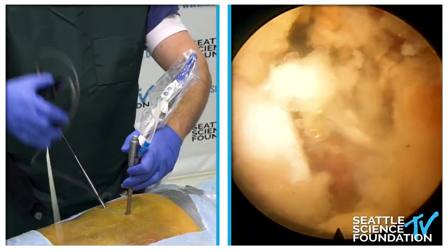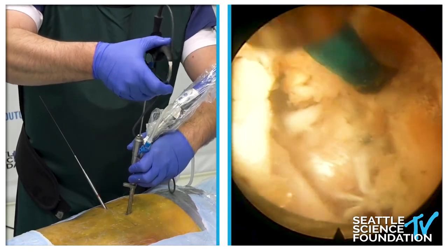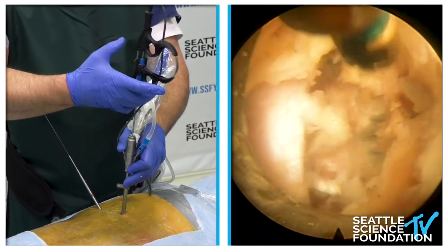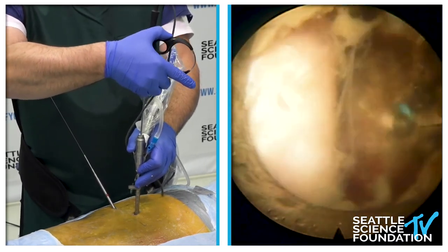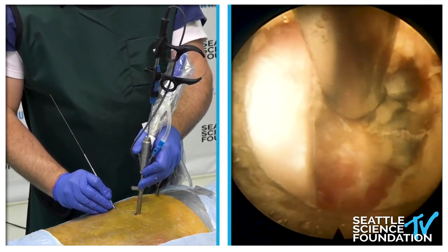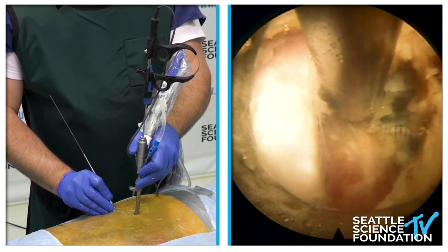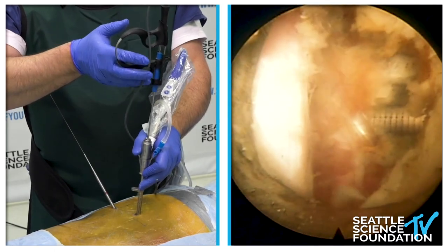Now we see much better. The optics are just amazing — how much they've improved the last couple of years. You can see the SAP is still here and my tube is right here — that's the tube delivering the graft. Here's the tube going in there — great visualization. We have a tremendous amount of space still for the traversing nerve root. The graduation is half a millimeter, so it's roughly five to six millimeters away from the traversing nerve root. We'll be in very good shape there.